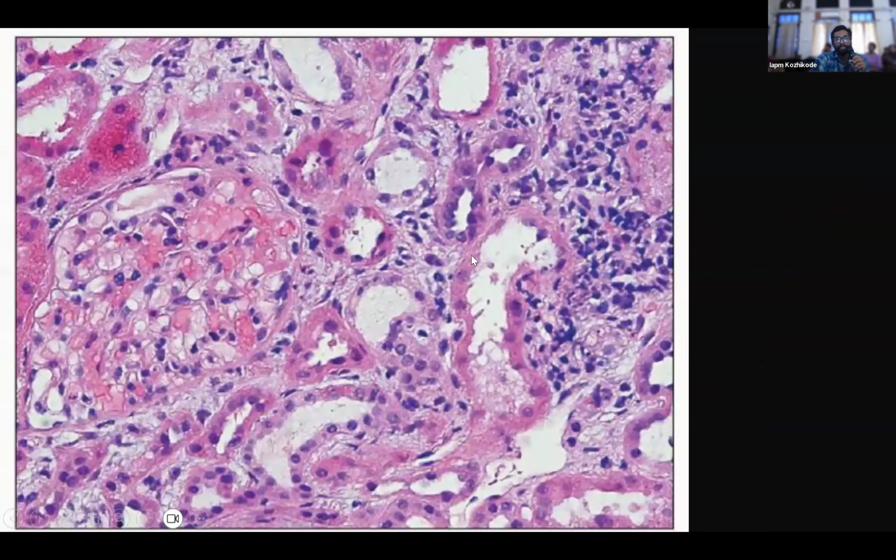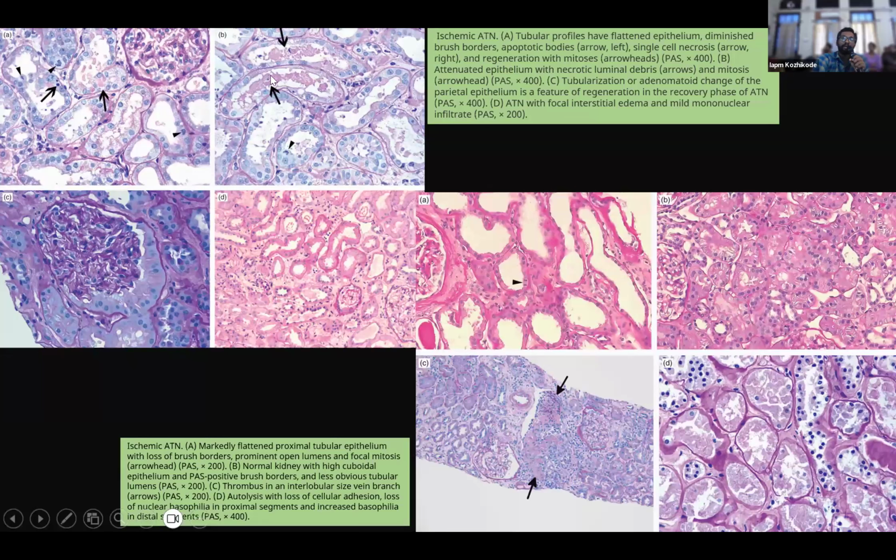But whenever some kind of tubulointerstitial injury happens, see how this looks like somebody has beaten the tubules. All the tubules are dilated, less colorful. See this entire area, you are not seeing any cell. There is loss of epithelial cells in this entire area. Only one cell here. You are seeing cytoplasmic vacuolation. There are no cilia, this entire space is dilated. And you can see lots of cells here, and cellular debris is formed in the lumen, that forms the cast.